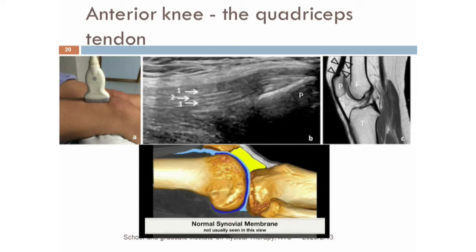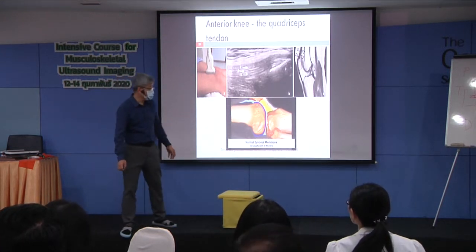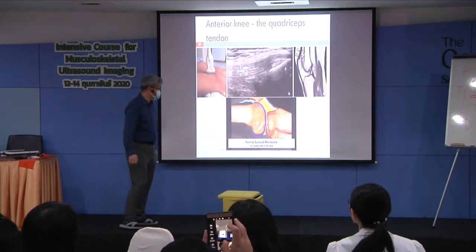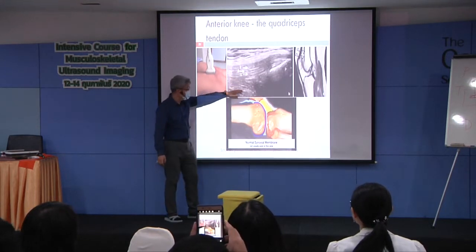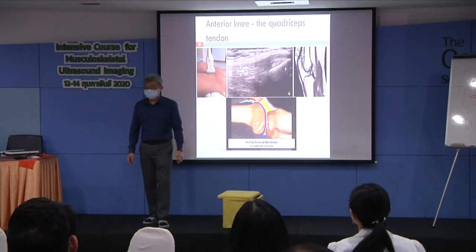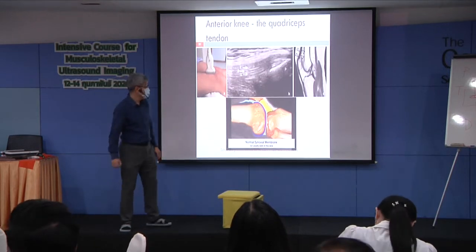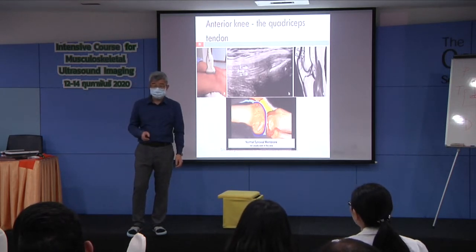If you email me or contact me with a picture, and ask me what it is, Professor Wang, I may tell you the tendon is not clear, the recess is not clear, the fat is not clear, the femur is not clear. I don't know what kind of imaging you sent to me. It's very common, really. So now you have been trained for more than one day.